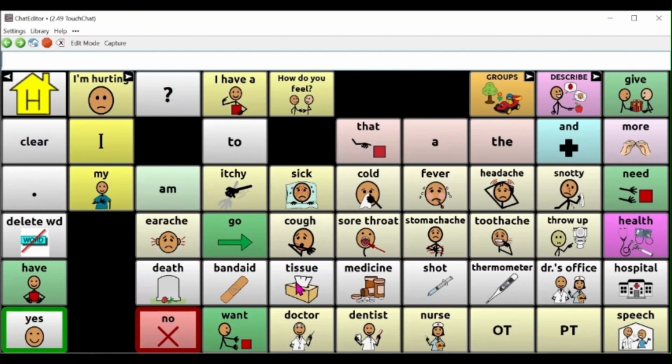Ooh, it looks like I need a tissue. And maybe I can hand them a tissue and help them blow their nose. But this is the way that we can model that language, like, I feel sick, or we're going to go to the doctor today.